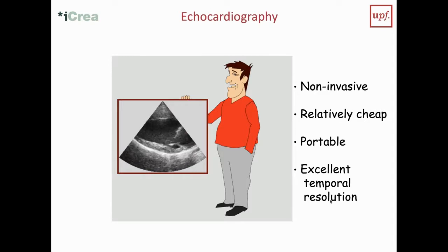And the other advantage, and that is also a major argument to use echocardiography, is that it has an excellent temporal resolution. Because the heart is beating fast, we need a high temporal resolution to look at function.